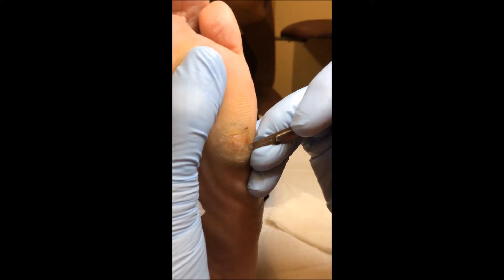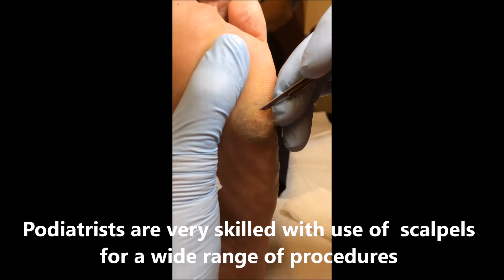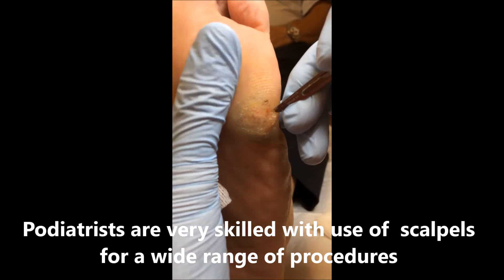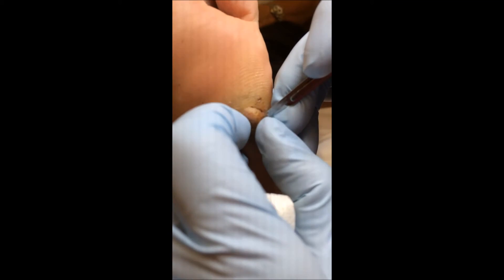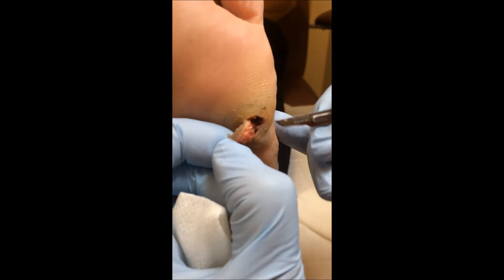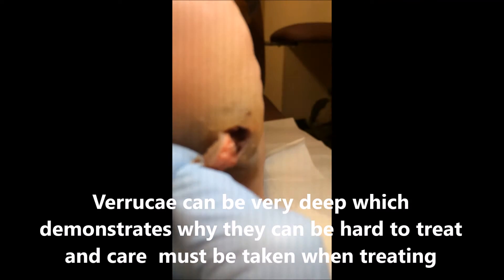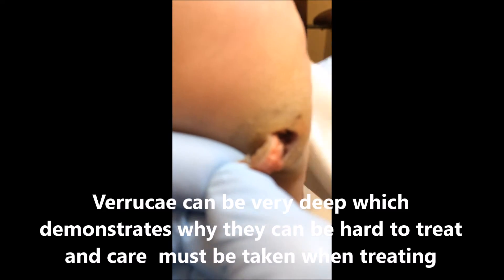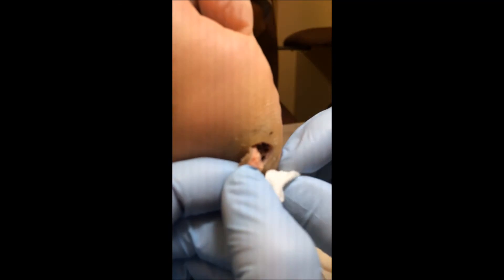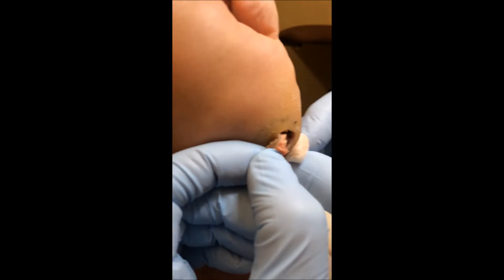So what we're doing, we're just going to get this opened up to allow some free draining, and you can see how deep that verruca tissue goes. I'm not going to be taking that right off today, but just enough to allow that to free drain, and we're going to put just a nice absorbent dressing on that.